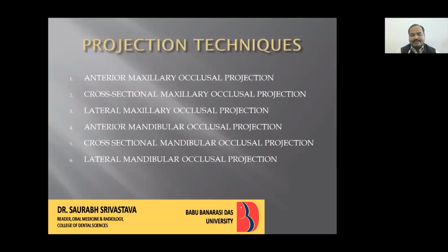The various projection techniques which are studied are the maxillary techniques and the mandibular techniques. For the maxillary techniques, there are the anterior maxillary occlusal projection, the cross-sectional maxillary occlusal and the lateral maxillary occlusal. The mandibular techniques are the anterior mandibular, cross-sectional mandibular, and lateral mandibular techniques.